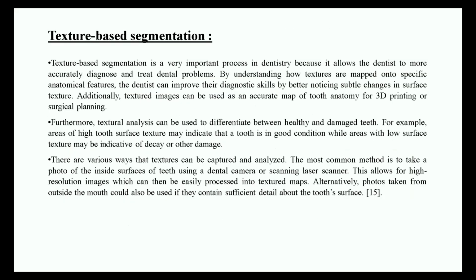The next one is texture-based segmentation. Texture-based segmentation is a very important process in dentistry because it allows the dentist to more accurately diagnose and treat dental problems. By understanding how textures are mapped onto specific anatomical features, the dentist can improve their diagnostic skills by better noticing subtle changes in surface textures.